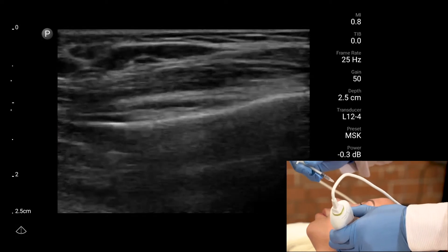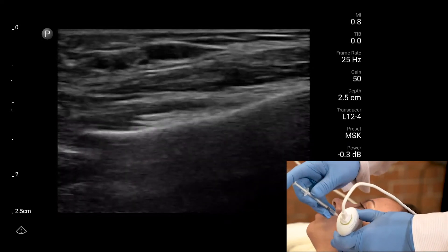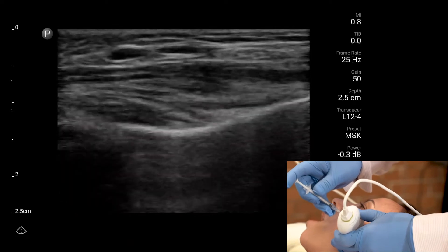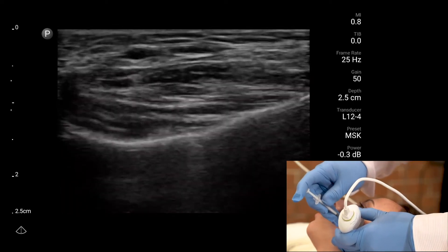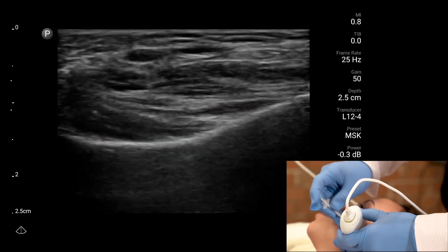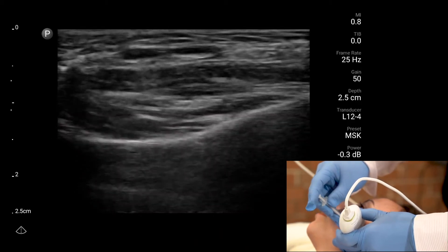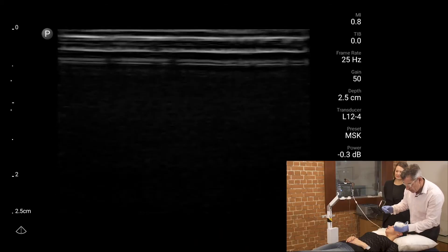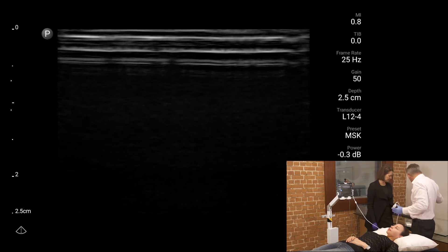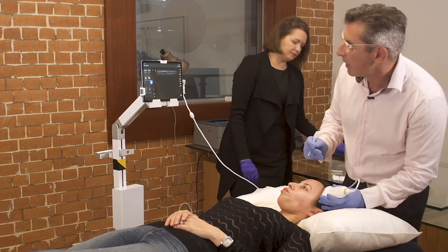For those of you who don't speak Latin, multi-pennate means many-headed. Open and close again and relax. Both injections done. So we'll have a look at temporalis now.